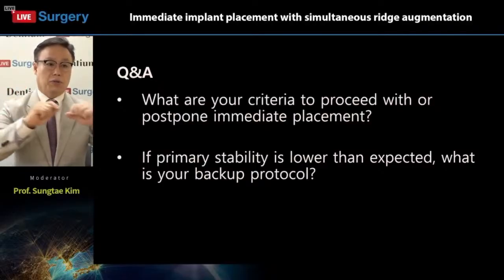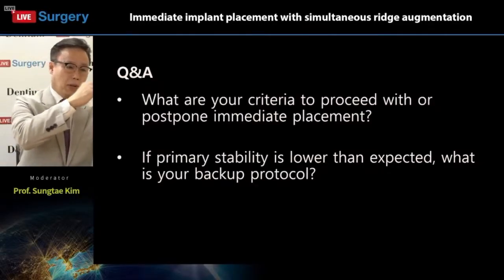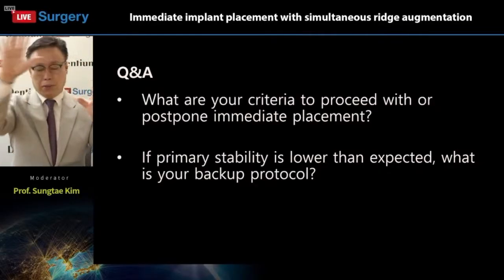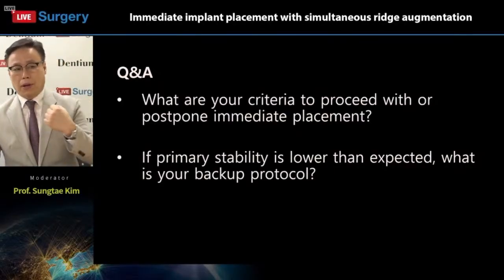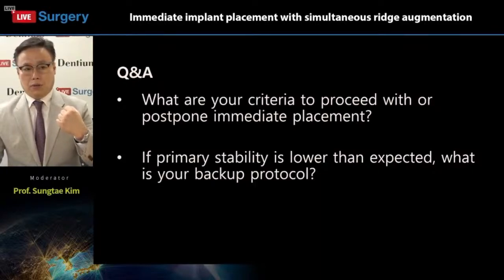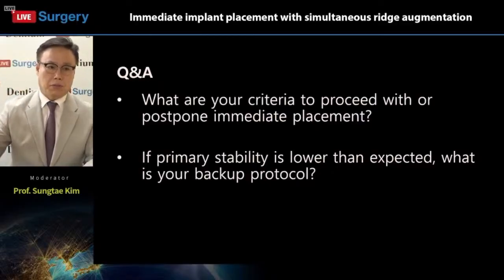However, you can choose either one. However, you have to understand the vestibular incision has this kind of advantage and this kind of disadvantage. Opening the flap and doing the transmucosal GBR also has advantages and disadvantages.